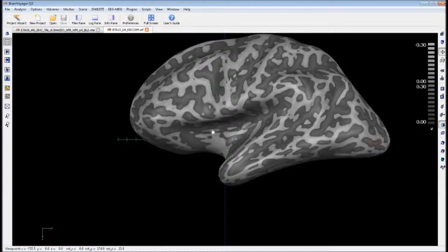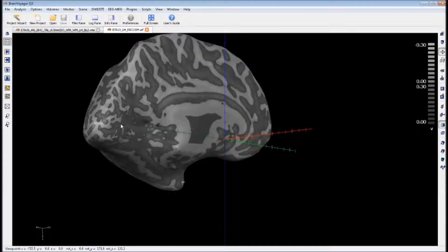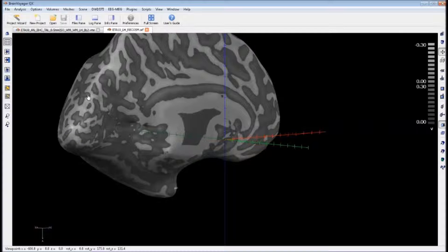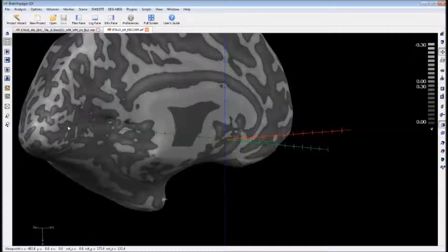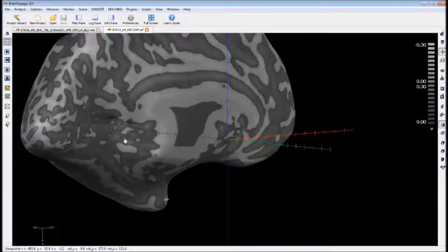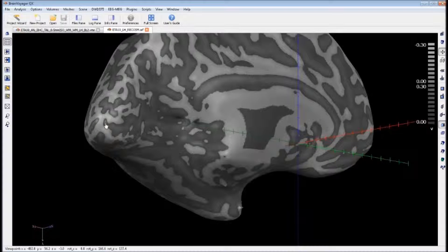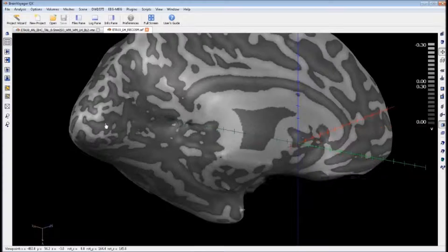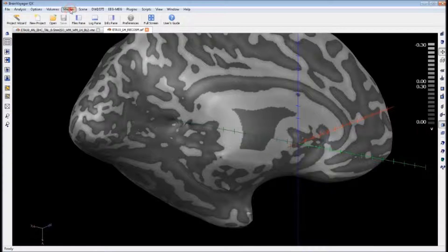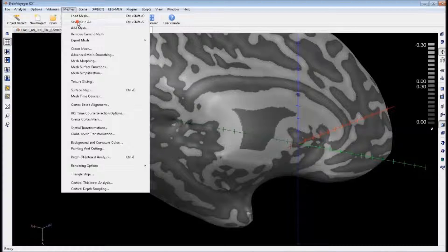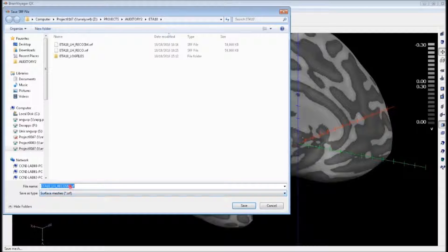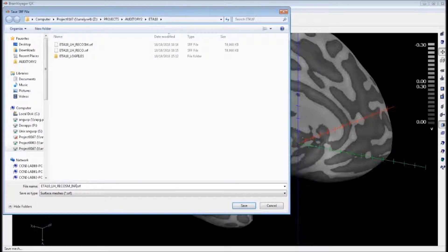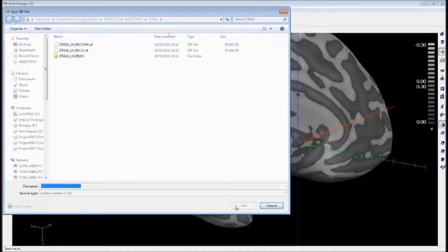We can spin it around to make sure everything looks okay. You can see it's a little pinched where the ventricle was at the back there. That shouldn't be a problem for our intended use. So we'll save this new mesh. We'll give it the extension underscore INF for inflated.